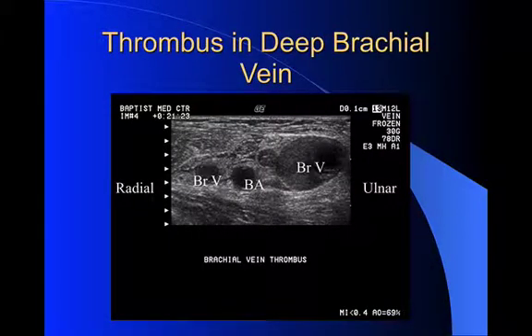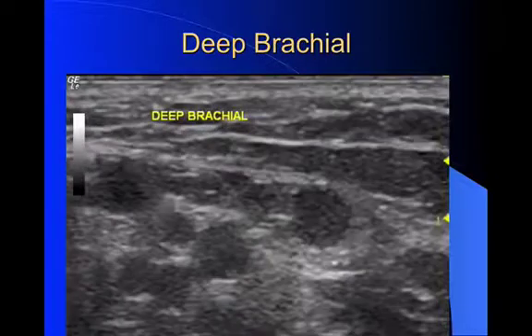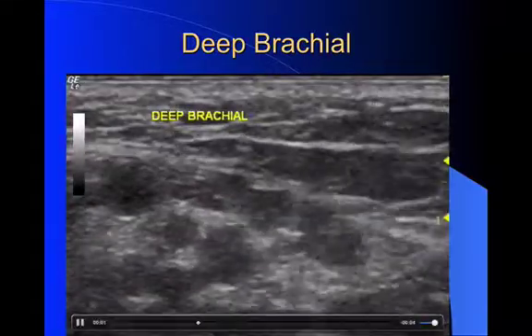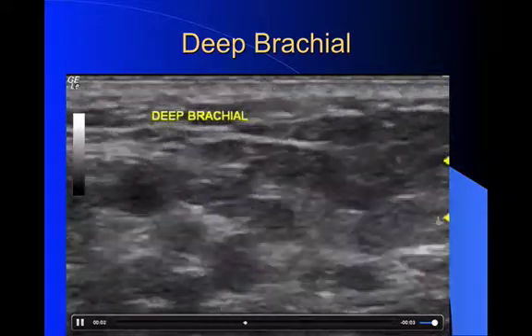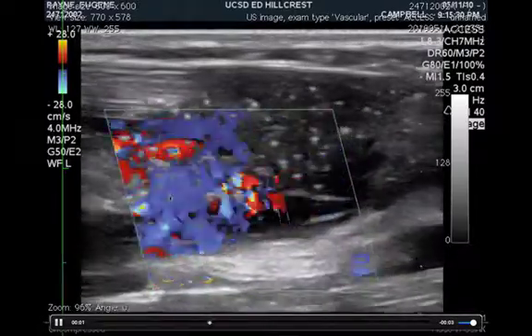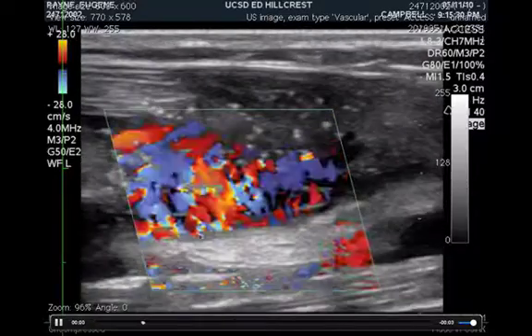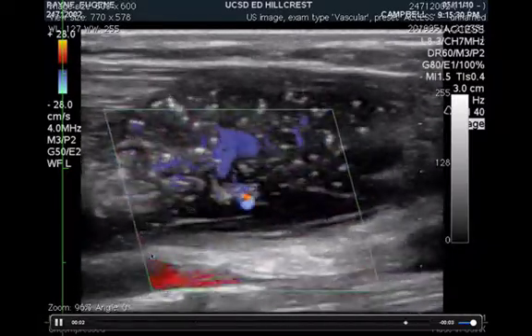This is what a thrombus in the deep brachial vein would look like. You will see the vein will be filled with echogenic material. And here you see an actual puncture of a deep brachial vein right over here. You see that the vein compresses, and then they'll get the cannula in. This is me trying to see if I was in the right spot. And what I did is I shot in some saline through my catheter that was under the skin, and I found that I had a lot of extravasation here, and I knew that in fact I was not in the right spot. So this is infiltration.